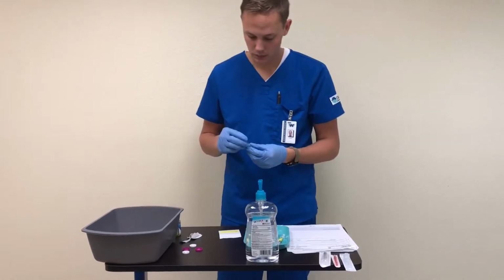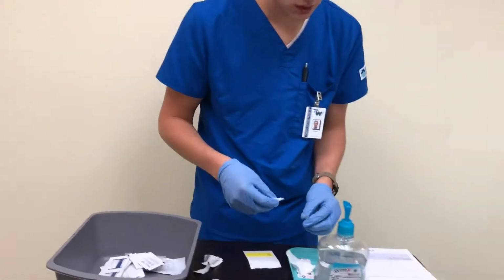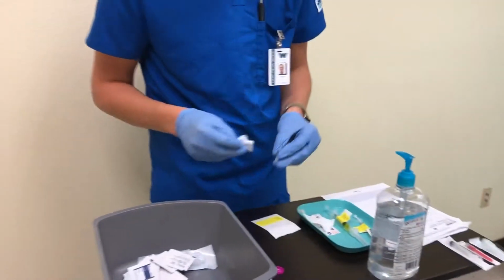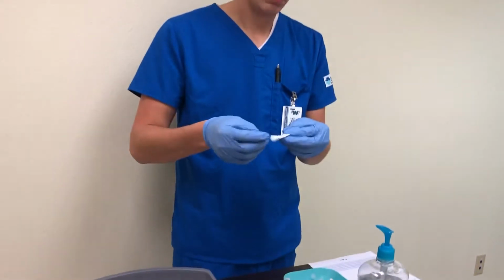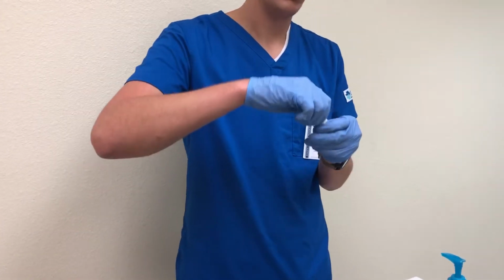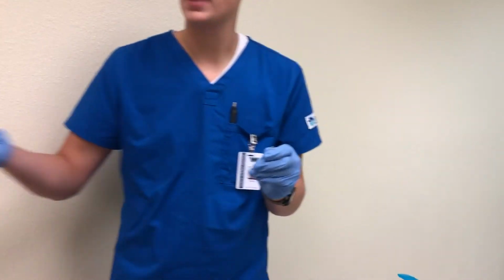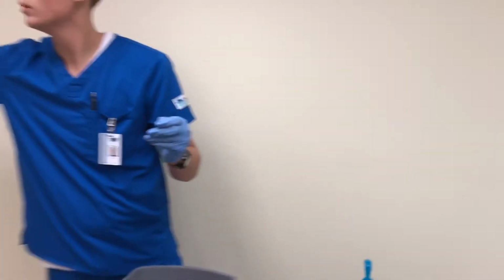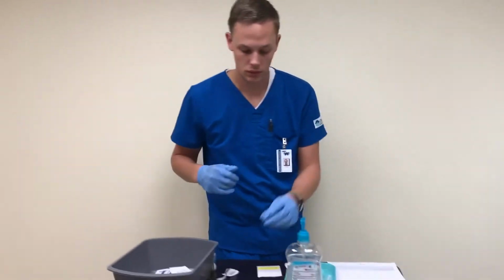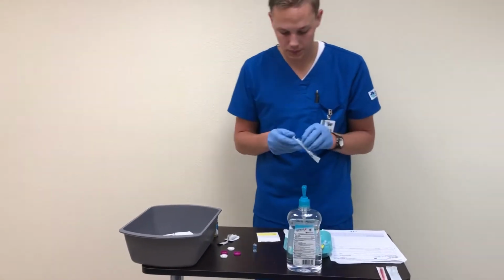Okay. And then I'm going to want to break it towards me so that any glass that shatters goes away from me. Okay. And then that can go into the sharps bin. I can set that down and prepare my needle.